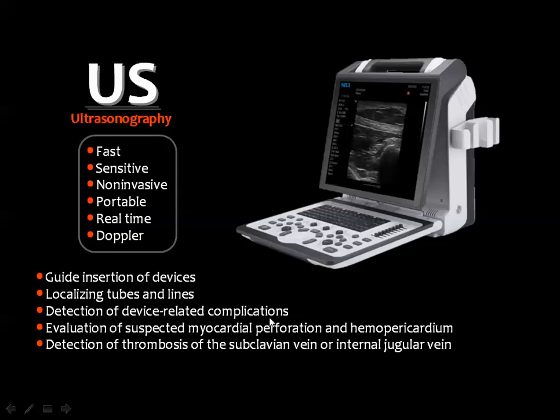Ultrasound is a very good machine to see pulmonary parenchymal lesions, pleural pathology, and mediastinal abnormalities, especially if the one who is handling the probe is eminent. Then you need a professional sonographer to see all that I have mentioned in the chest abnormalities.